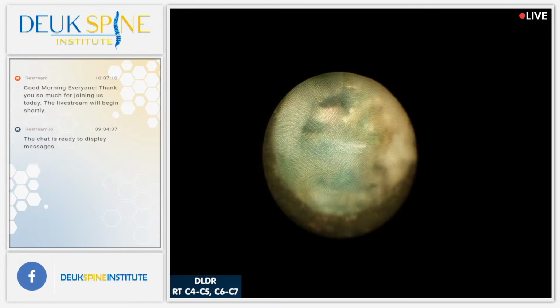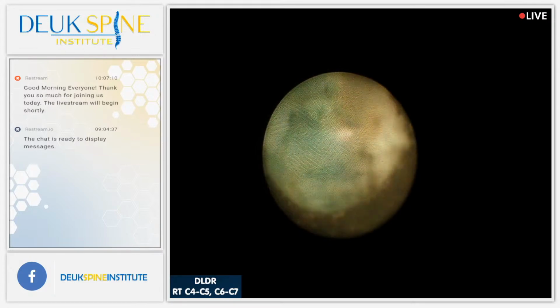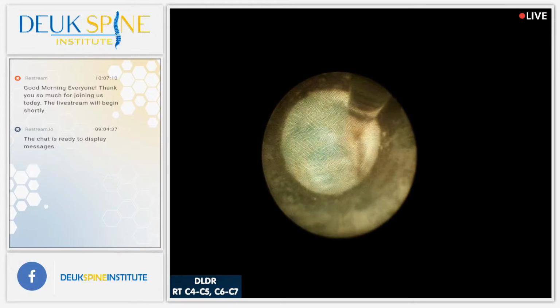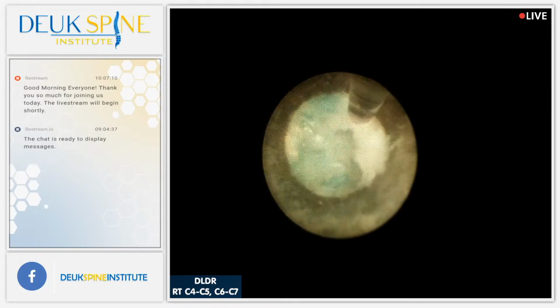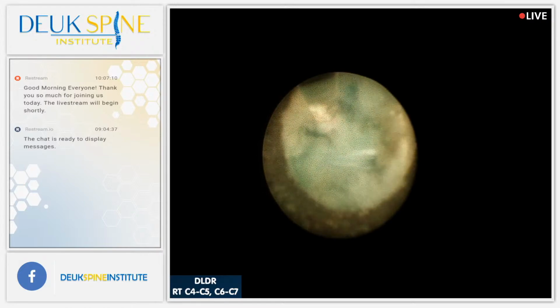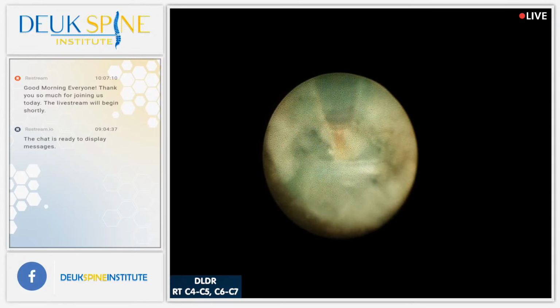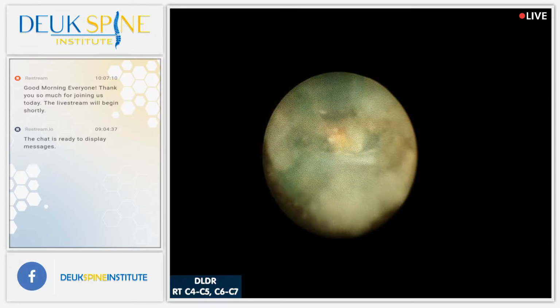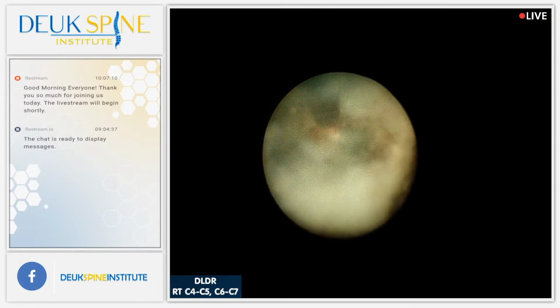Most patients don't have a ligamentous tear. They just have an annular tear. And the herniation remains above the posterior ligament. But in this patient's case, the herniation is so bad that it's gone through the posterior longitudinal ligament. That's it right there as well. You see that? I'm literally breaking up the herniation that's sitting on top of his spinal cord with the laser.